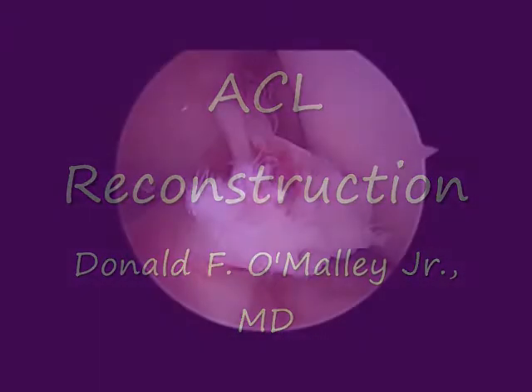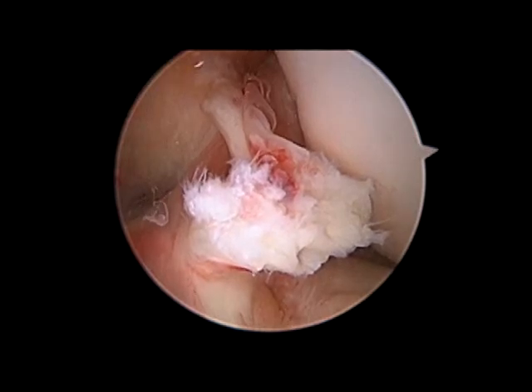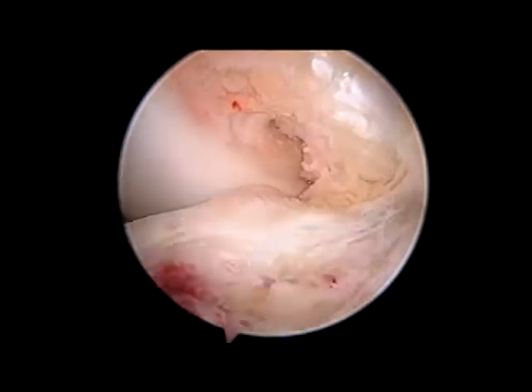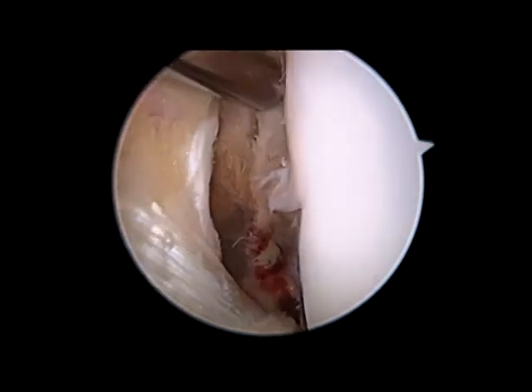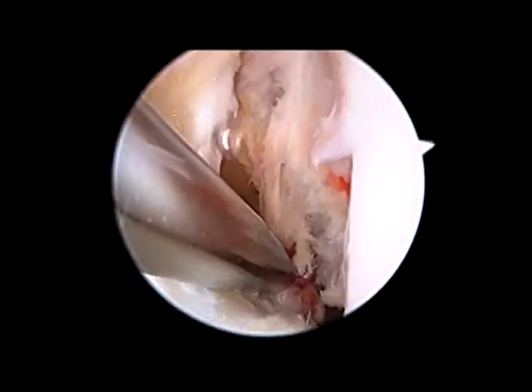Welcome to this video on ACL reconstruction using patellar tendon autograft. The stump of the torn ACL is visible in the center of the screen. The first step in the reconstruction, after harvesting and preparation of the graft, is to remove the torn remnants of the injured ACL. It is easily removed from the notch with a motorized shaver. It is important to remove all of the tissue to prevent future loss of motion.